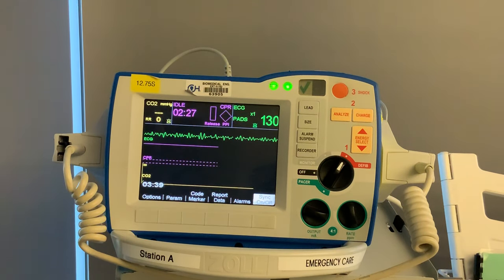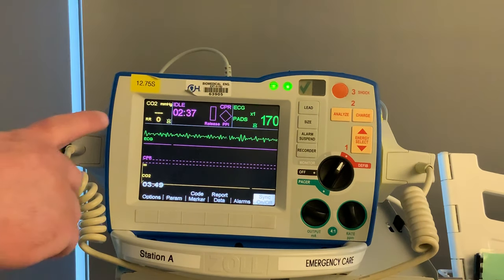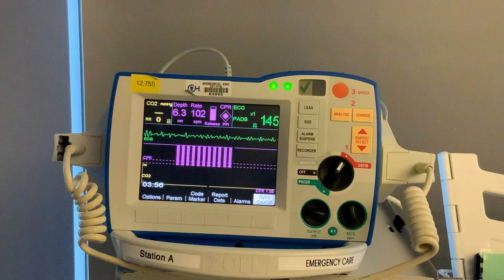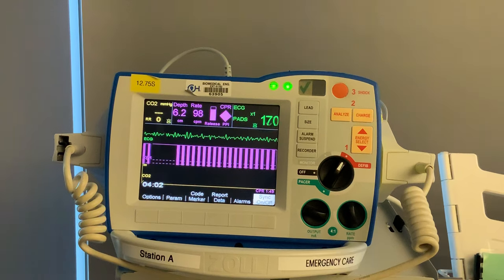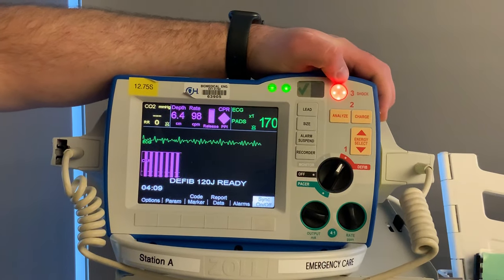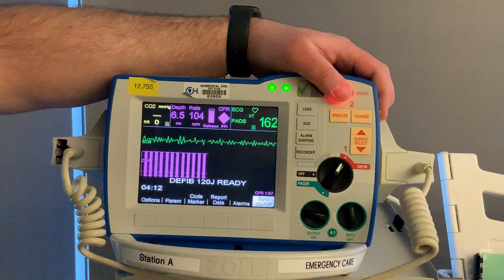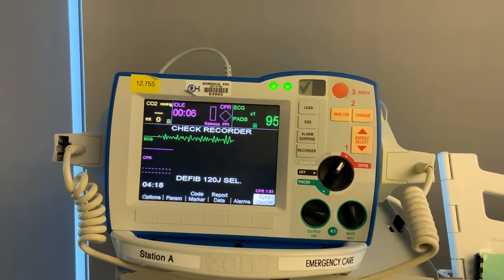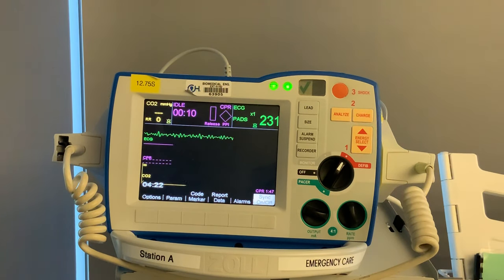If the patient is in VTAC without a pulse, or you see VFib on the monitor, the first thing you do is start CPR. While CPR is in progress, you'll see depth, rate, release, and the perfusion diamond. Since we already have our pads on the patient, we'll get ready to defibrillate right away. The range for defibrillation is 120 to 200 joules. Select your energy — we'll go to 120 — and charge. Once charged: arm clear, mic clear, oxygen clear, shocking in three, two, one. Shock delivered, then resume CPR. Every two minutes, stop for a pulse check and rhythm check, and shock again if still in VFib.